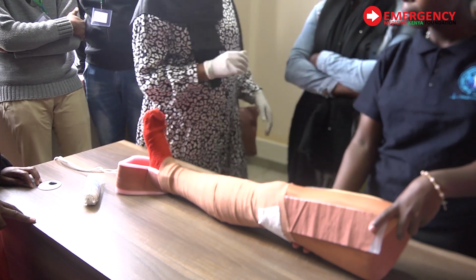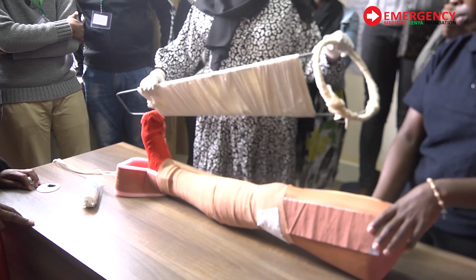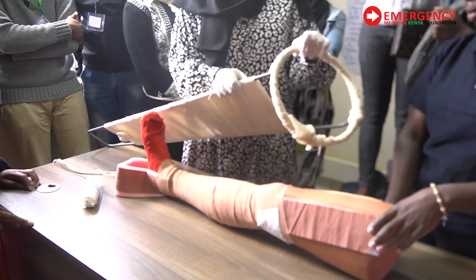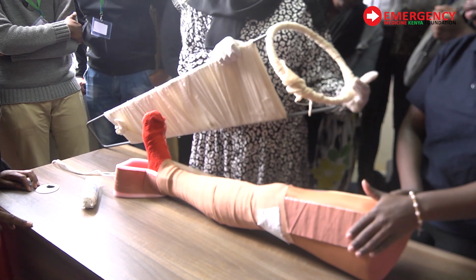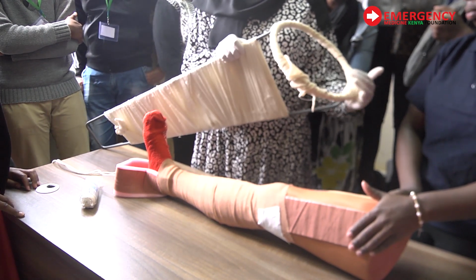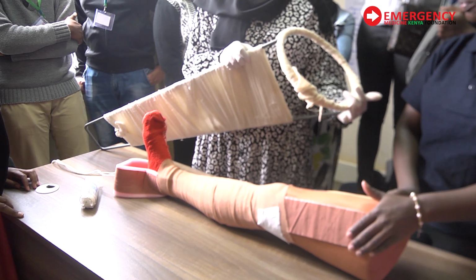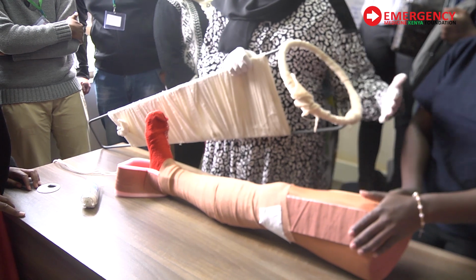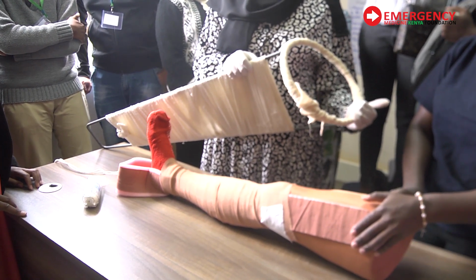So now the challenge with this thing, the most important thing is to avoid this metal sitting on the greater trochanter of the patient, or the butt, and the patient gets pressure sores from this. It becomes very difficult to heal, okay? Because the patient is in so much pain, you think actually it's the fracture. Kumbe the guy is getting pressure sores from here, and then you have another story to deal with, okay?